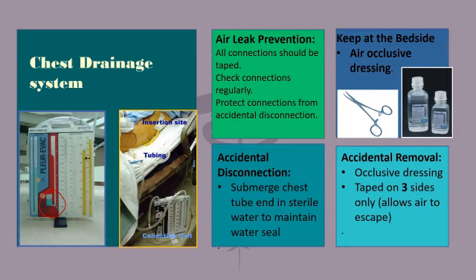Sometimes there's an emergency, and maybe the whole chest tube drainage device falls over and breaks. You're on your way to x-ray, and the porter runs over the wheelchair and this breaks, and you don't have time to go back to the floor to get a new one because now your patient might be compromised.